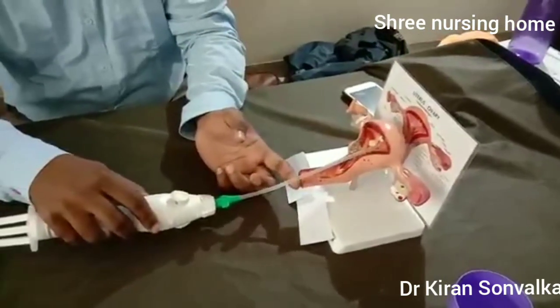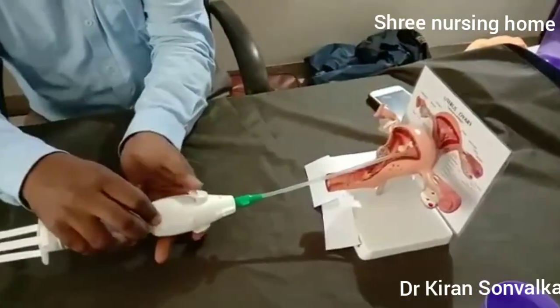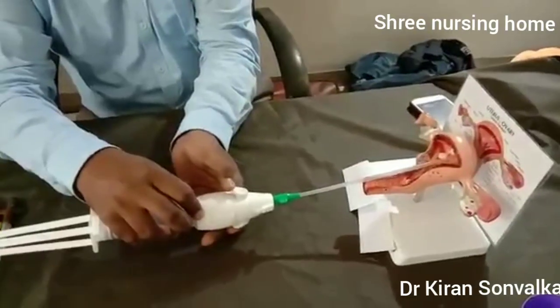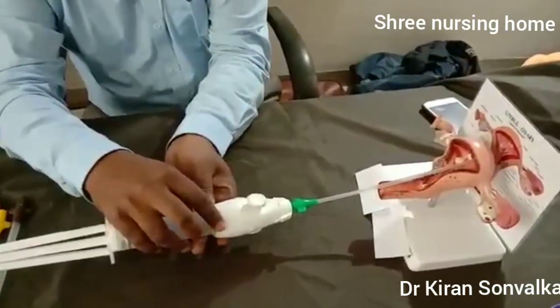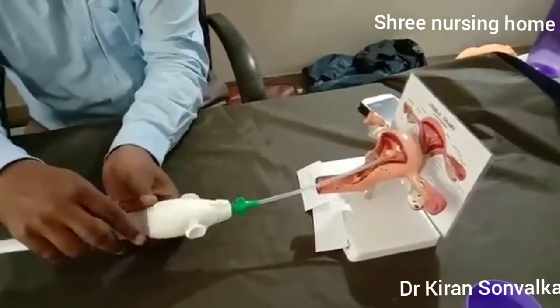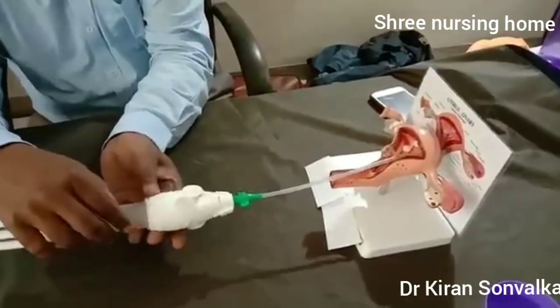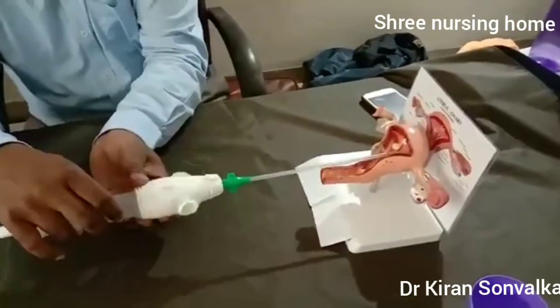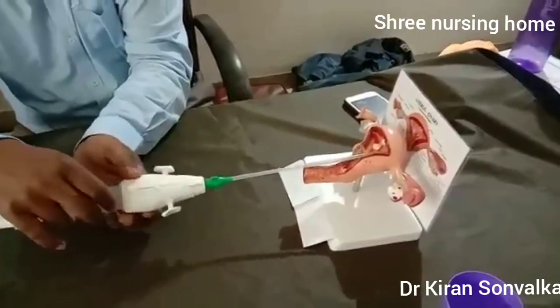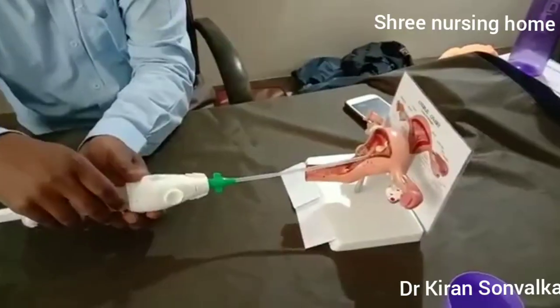Now considering this model where cervical dilatation is already done: put the cannula inside the uterus until it reaches the cavity. After going into the cavity, release the vacuum by pressing the valve button, then do clockwise and anti-clockwise rotation until the product of conception comes into the syringe. Once you realize the vacuum is empty or the syringe is full, remove it.